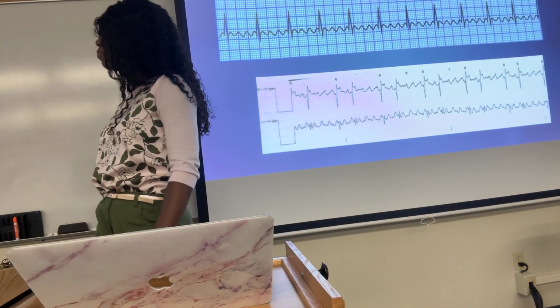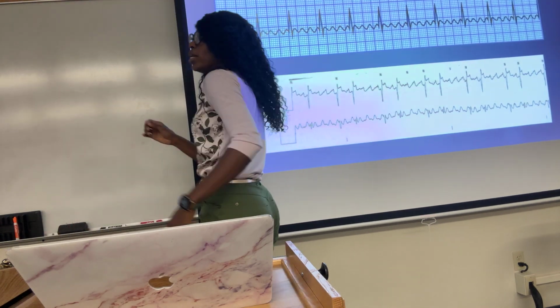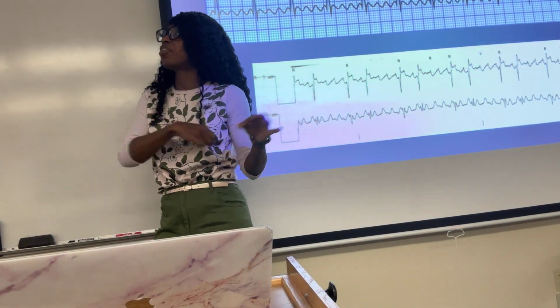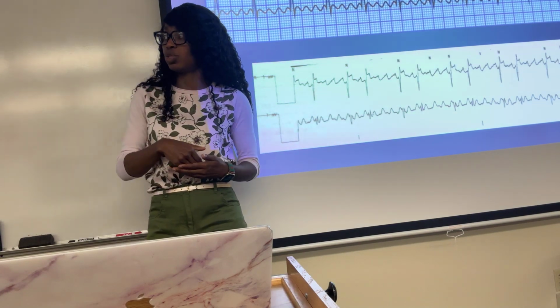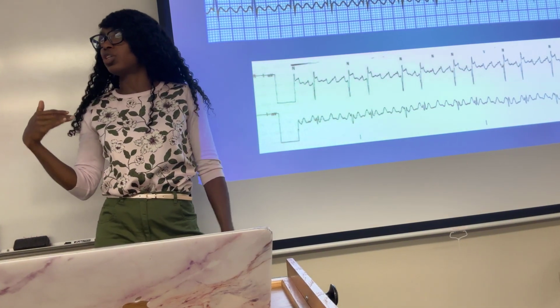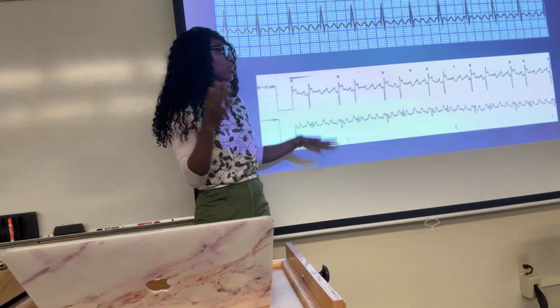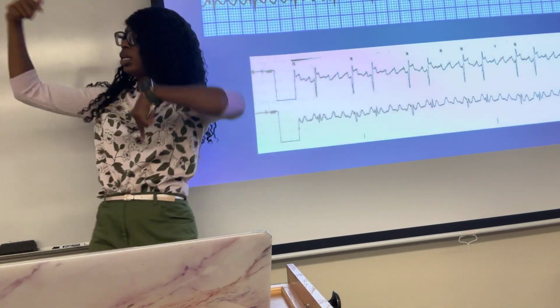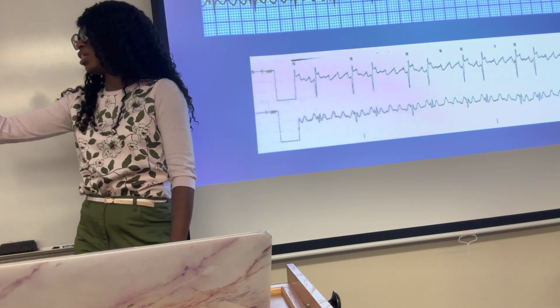I have a question. On the bottom picture, there's 2 lines. Am I missing something? So we know that EKGs are 12 leads, right? They are measuring different places and seeing the electrical signal in different views. So this is, we would say, a 2-strip. This is one view, this is another view, and other ones will show different sides. They could select which view they want, which angle they're looking at the heart. Usually the cardiologist would ask you to give them this one.